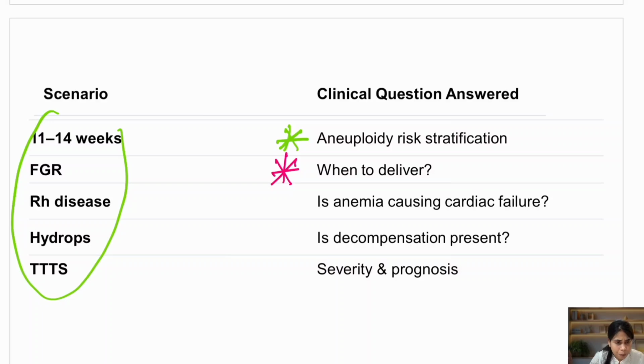So now the Doppler which becomes important is the ductus venosus. You take the patient for regular biophysical profiling, cardiotocography is done, steroids are given, and ductus venosus Doppler is also done. The ductus venosus, I have said, is the last one to show the changes.